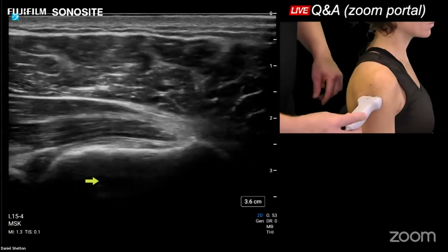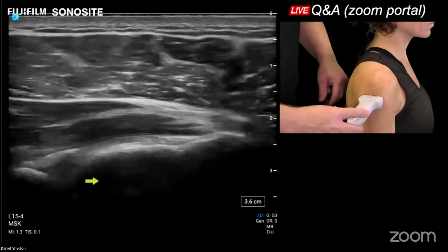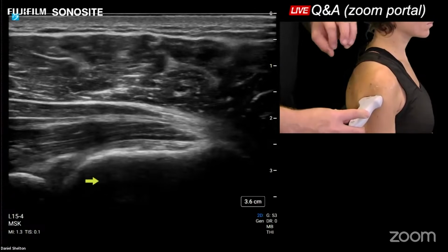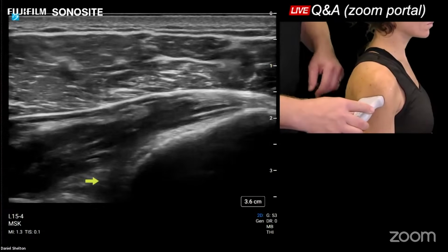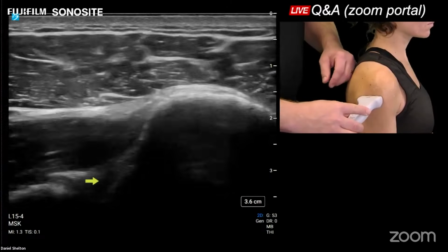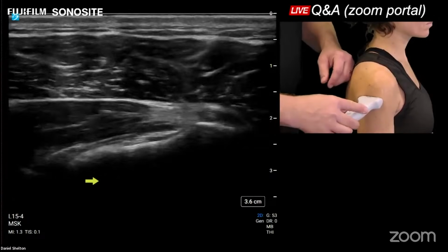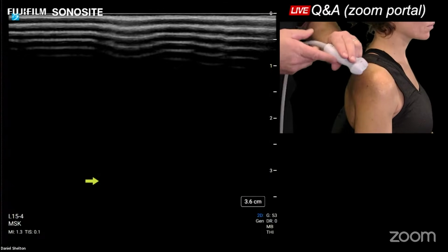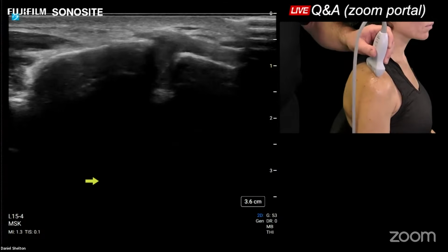I don't scan like this like a stethoscope, but I want the camera to be able to see that acute angle that we're having to take to go long axis to the teres minor. It's pretty sharp. So you're scanning a ball and we're on the undersurface of the ball aiming up, so we can keep that skeletal reference point. And we could externally rotate slowly and see the teres minor tendon footprint come in, and then internally rotate. Good.